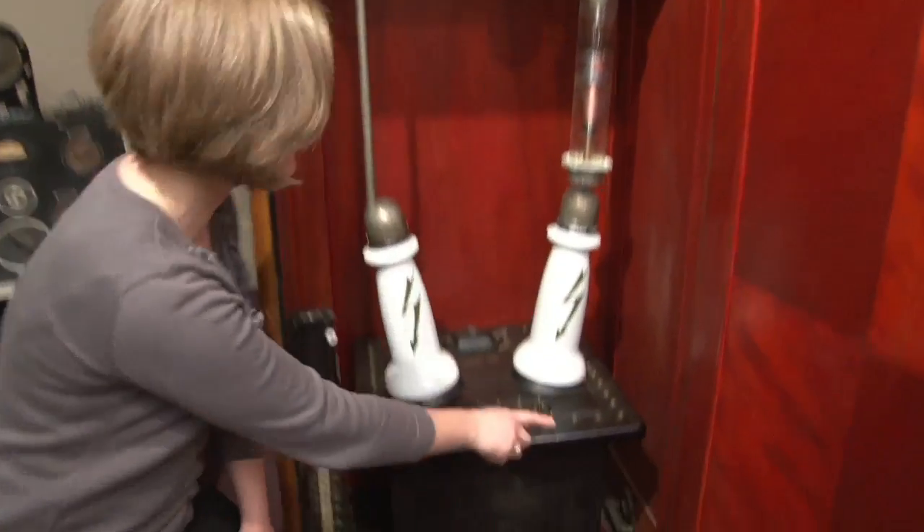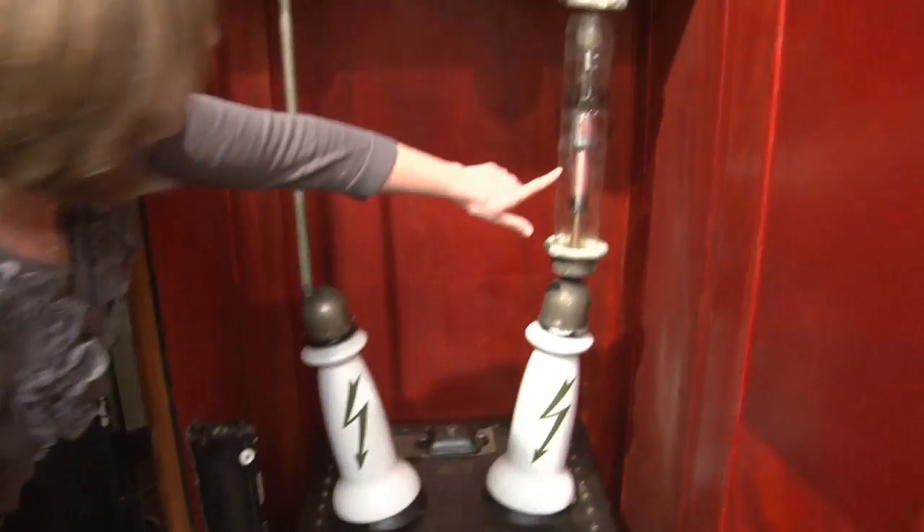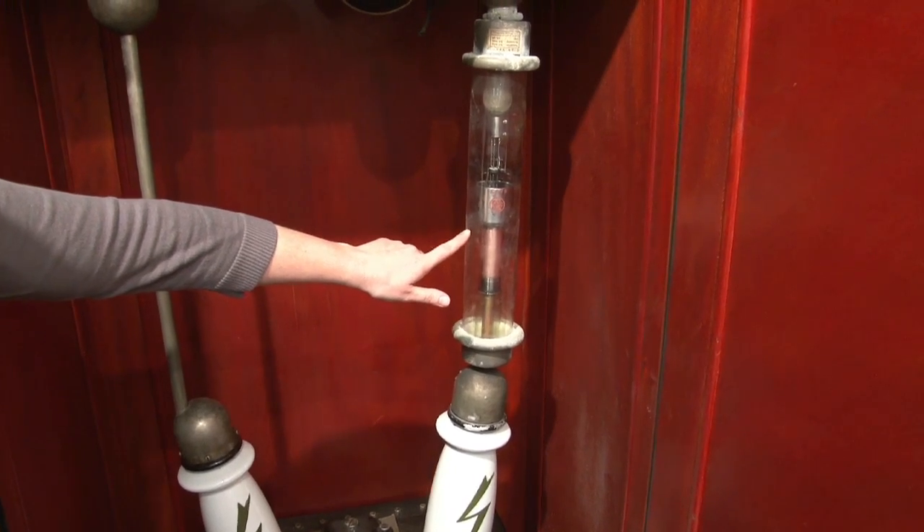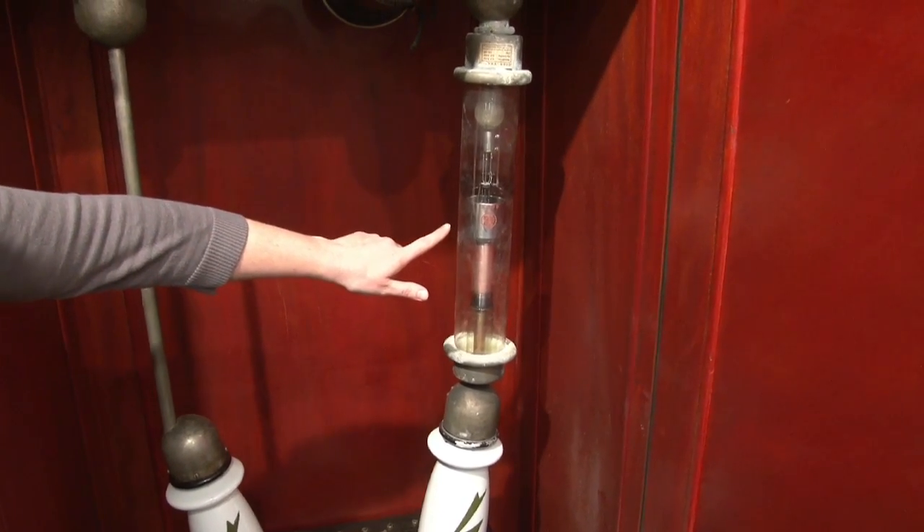This machine comes with a beautiful wooden cabinet that houses the equipment to generate the electricity to run this machine. This is the rectifier that changes the alternating current to direct current electricity, which is what is needed to run x-ray tubes in the 1930s.